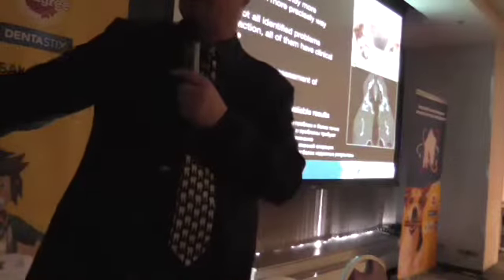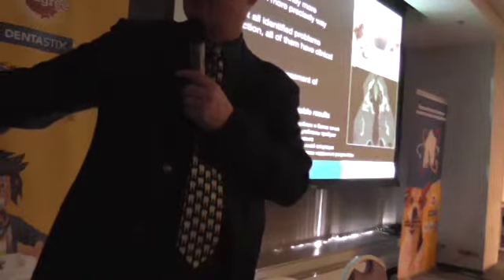We also can see the fracture of a condylar process here.